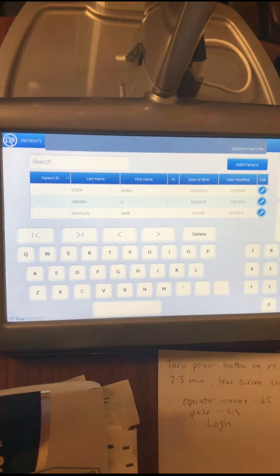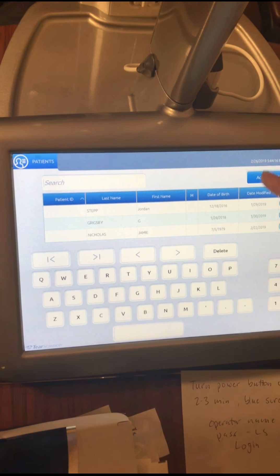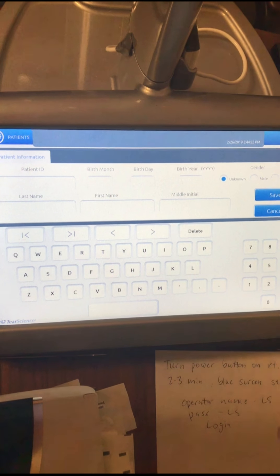Once you log on you'll see this screen right here and you can search for your patient here, or if they're not in there you can do add patient and fill out ID, birth month, birthday, birth year, last name, first name, male or female, and then hit save.